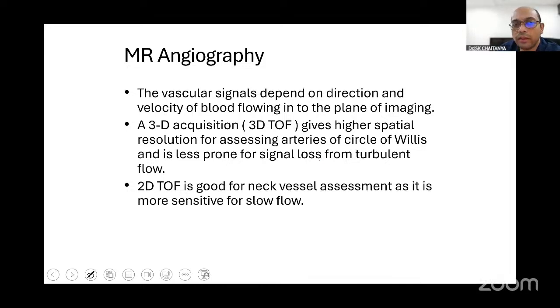Next modality is MR angiography. Over the last 8-9 years, after newer trials like the MR CLEAN trial, for patients who come within the time window, apart from thrombolysis, if there is a large vessel obstruction like the carotids, internal carotid artery, or middle cerebral artery up to its M1 segment, there is scope that revascularization can be attempted by doing an interventional thrombectomy.